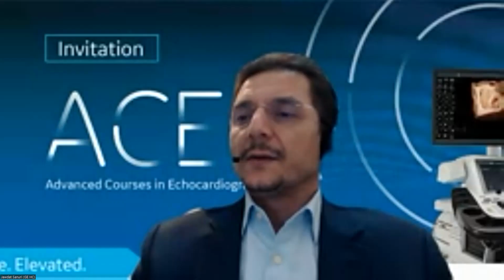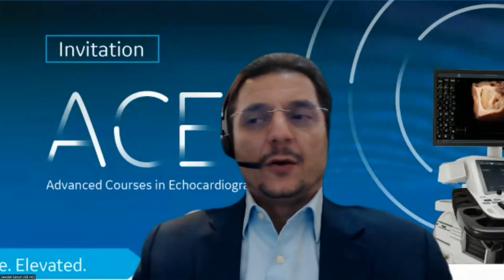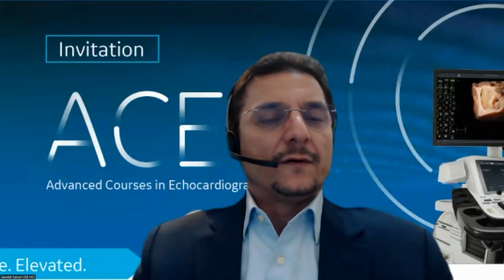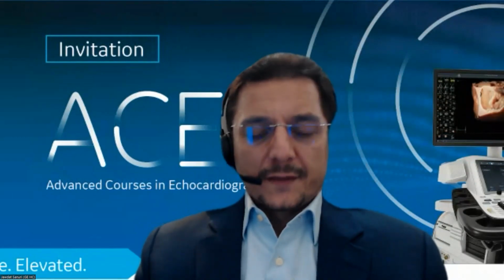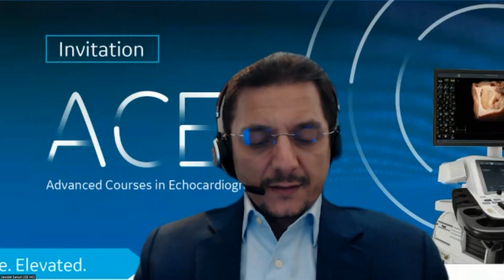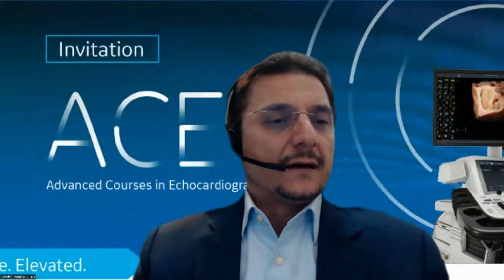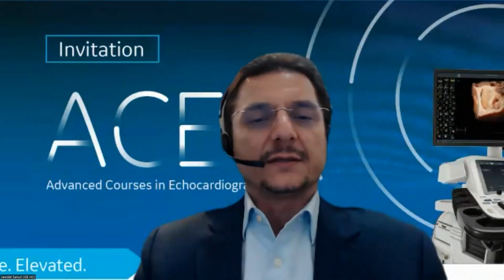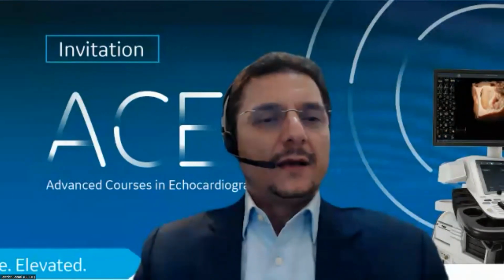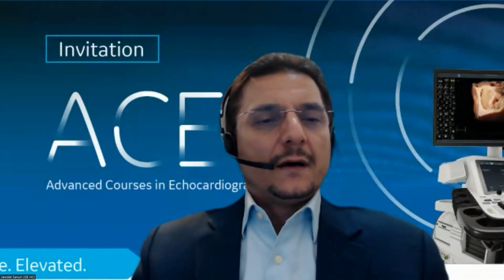Strain test for dilated cardiomyopathy, follow-up and treatment response. Yes, you get the global longitudinal strain. So if it's a global cardiomyopathy or dilated cardiomyopathy, then yes, the global strain will change, and you can follow it up with the patient responding to either therapy or other things that are being done for global hypokinesia.